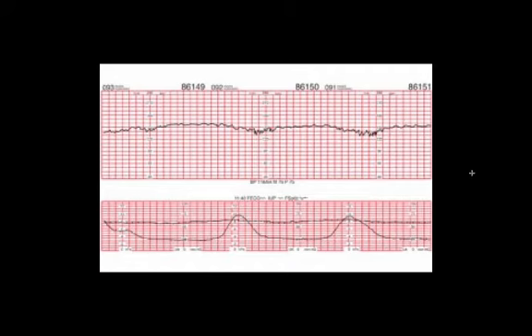If she has Pitocin, we would turn off that Pitocin because we know that these contractions are causing the stress that's making the baby's heart rate decrease. We'll also check the blood pressure to be certain that it's not low blood pressure that is causing a change in the fetal heart rate related to uteroplacental insufficiency.